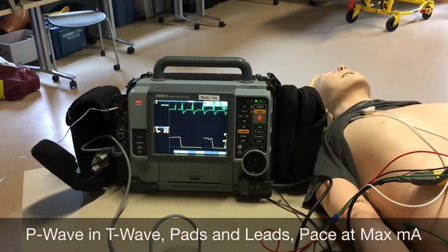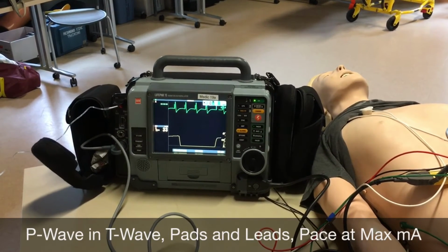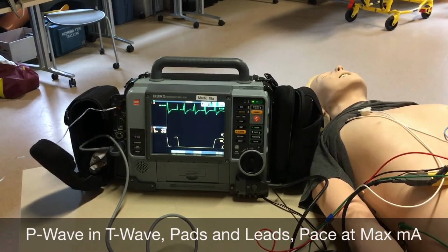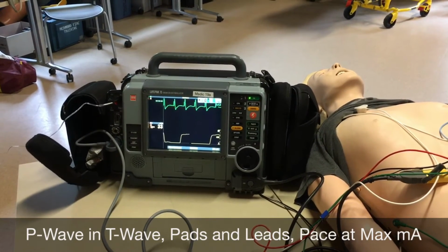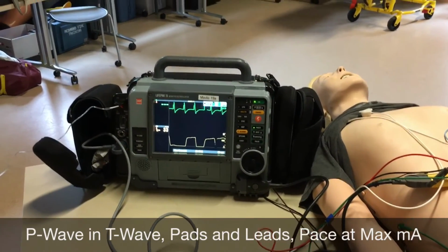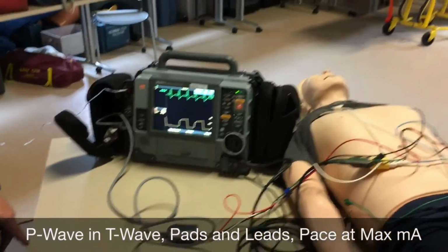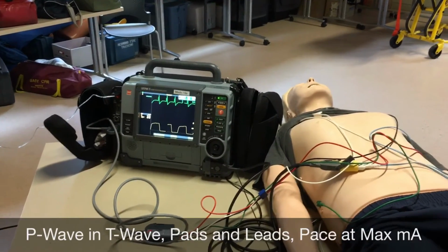So in summary, we know now that, one, third degree heart block can be narrow or wide, but it is the only rhythm where P waves fall in the area of repolarization, in other words, P waves in the T waves. Two, we know that we need to have both the pads and the leads on in order to pace.